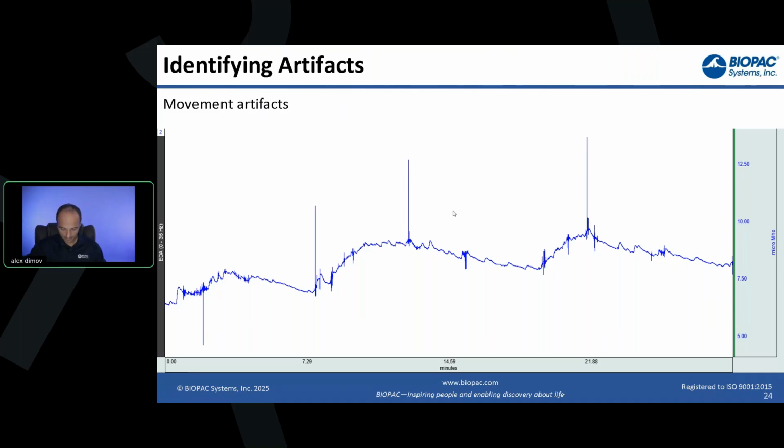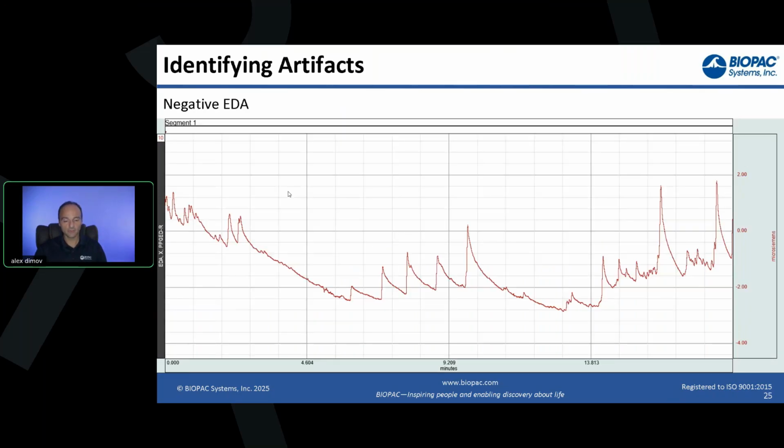I have here on myself electrodes in 2 different positions, by the way. So if you do something like that or tug on the leads, that's why Fraser recommended taping the leads, you get these spikes, even if you have done a very good job at signal preparation. So you tape down so that doesn't happen, and make sure that you have enough gel. So you can get these, and these are fairly easy to deal with. I'll show you how to deal with that.